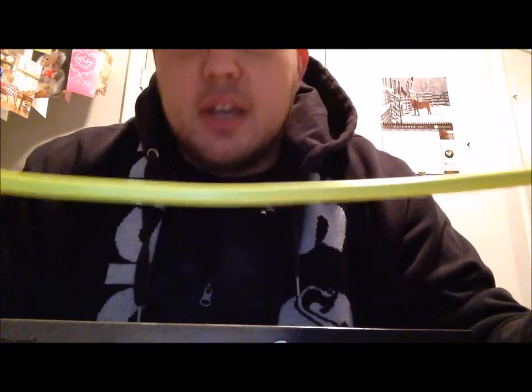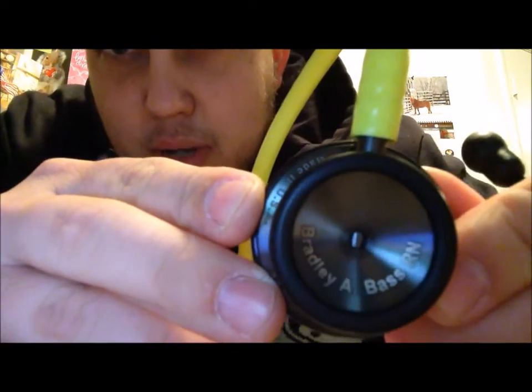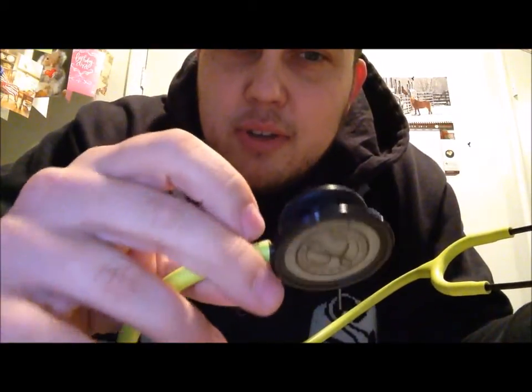It said lemon lime tubing, which I guess it is, but it looked a little more vibrant than this — it's more of a spearmint. I think it's pretty dope and it's got the black and the engraving. Let's see if I can get that — 'Bradley Abass RN.' It's showing up backwards on my screen, I hope it's not backwards for y'all. It's got a nice smoke finish which actually to me looks more black, and the smoke finish on the ear pieces is pretty soft — they're also smoke.